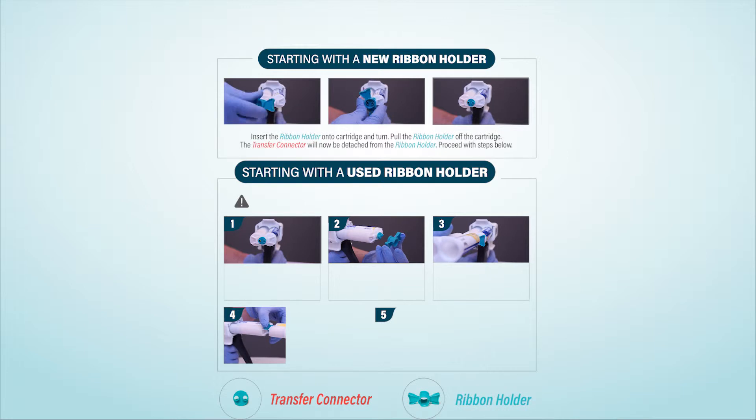Starting with the new ribbon holder, insert the ribbon holder onto the cartridge and turn. Pull the ribbon holder off the cartridge. The transfer connector will now be detached from the ribbon holder.